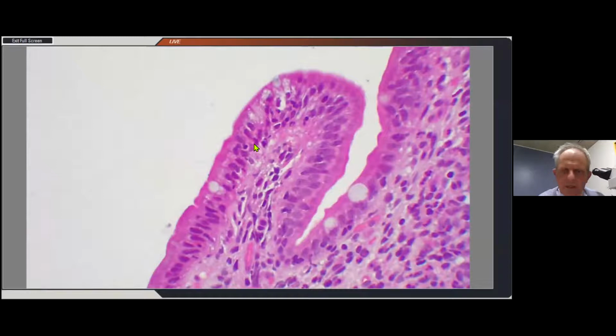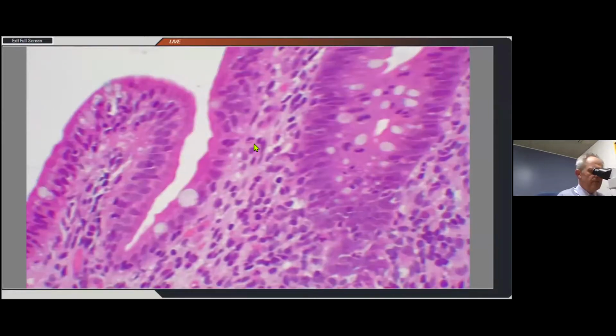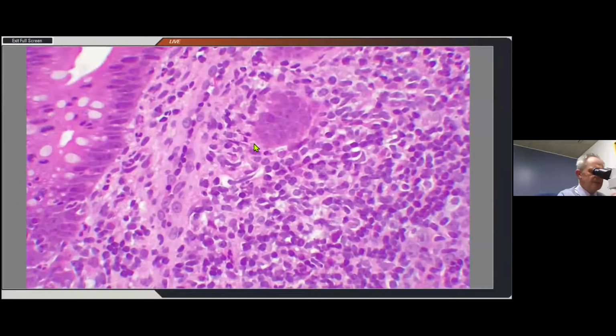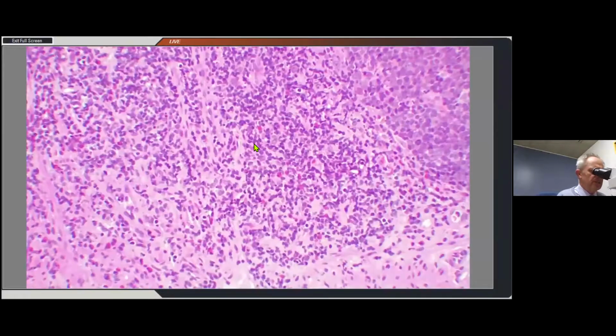And as you know, you shouldn't get neutrophils in celiac disease. If one looks, for example, at Odze's textbook of gastrointestinal pathology, you'll see that this entity fits into the category of what we call active chronic duodenitis. And that's what we called this. This is not celiac disease.